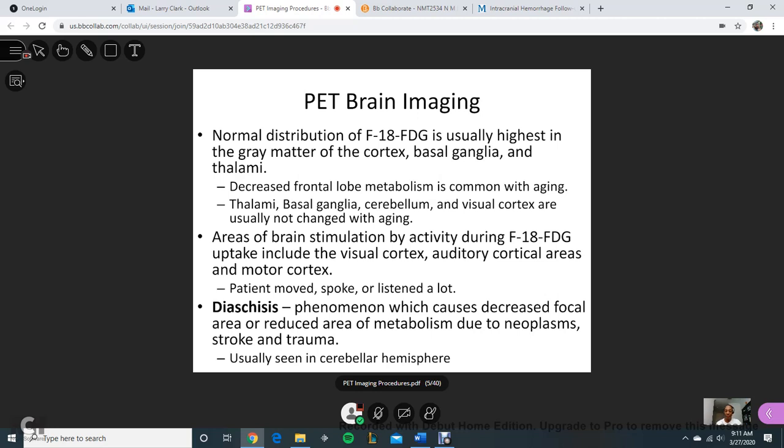Have any of you done a PET brain, or have you just done a whole body for tumor? Whole body. Okay. If you do a brain in the future, you're going to realize that the patient comes in and you quickly do what you need to do as far as injecting them, but then you put them in the room, turn everything off, and encourage them not to read anything.